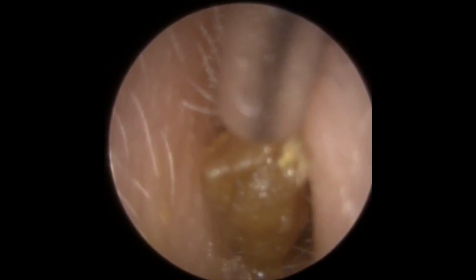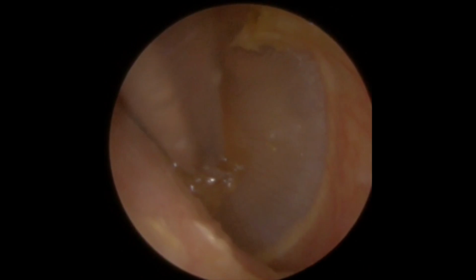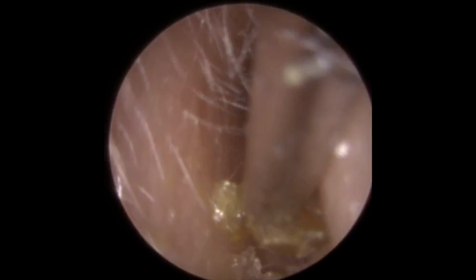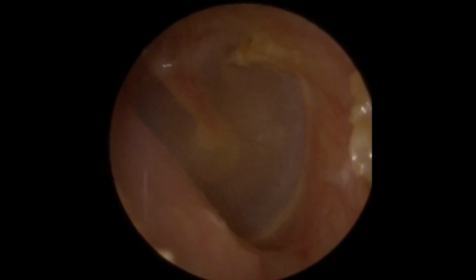There we are. It's all coming away now. Oh, got a bit stuck. There we go. And there we are. We can see we've got that harder piece there sitting in the center of the eardrum, so just want to grab that. This lady did so well. She sat through so much for this. And there we go. Oh, nearly fell off. There we are. Okay. And there we are.